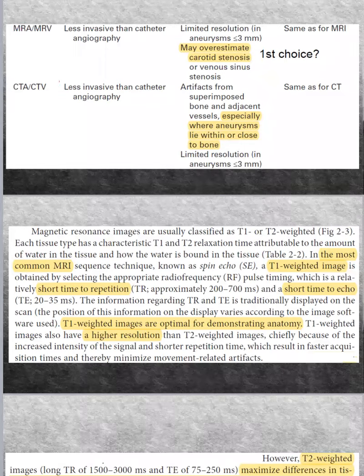By the way, they have the advantages, disadvantages and contraindications like those of MRI and CT. But here I highlighted this: the MRA may overestimate the carotid stenosis.